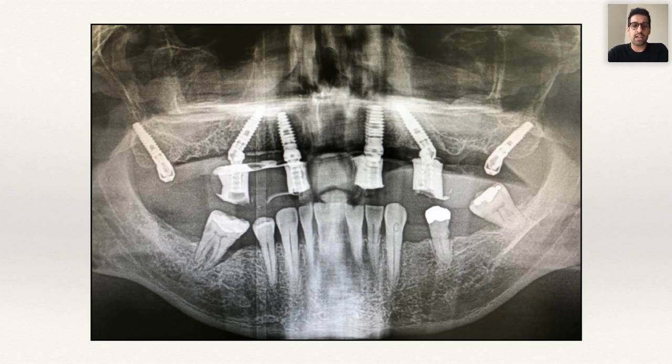You do need to just be careful with your angulations, especially if you're combining distally angled implants in the anterior maxilla with pterygoid implants, that the angles and the divergence of the implants aren't too great, because again, that can potentially make creating a passive metal framework difficult. So just be wary of that. And so you need to be spot on with the prosthetic side. It's not just about sticking the implant in, it really is prosthetically driven. So here you can see perfect AP spread.